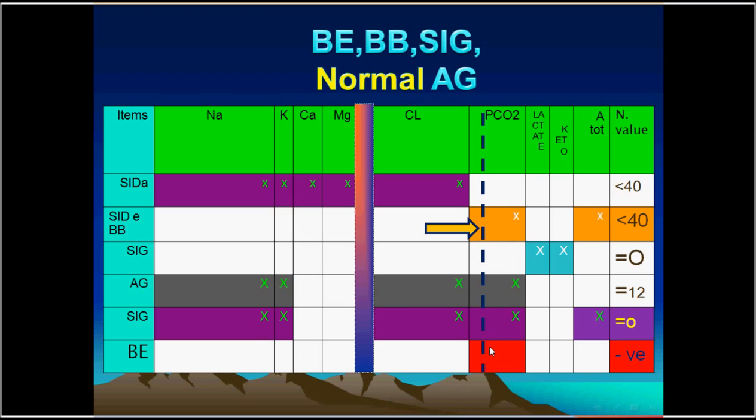So when you come to the base excess, this is metabolic acidosis with decrease in the bicarbonate. So there is a negative base excess. Base excess here is a base deficit. So this is the relation between them when you study this chart with the pathology. I think it's easy if you remember all this.